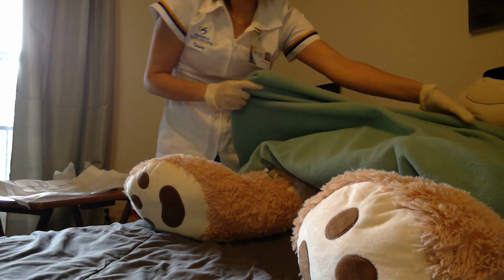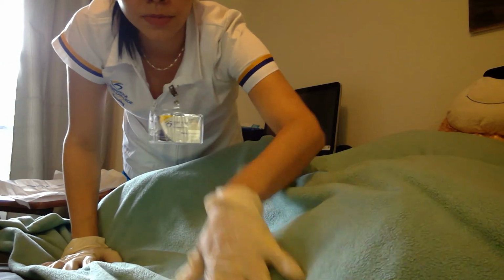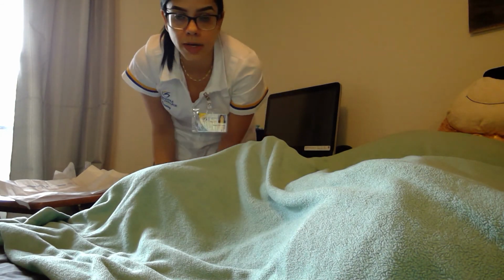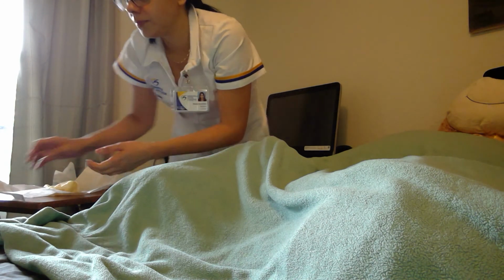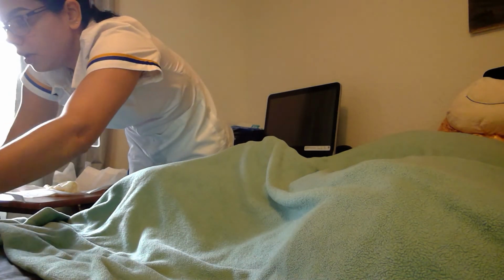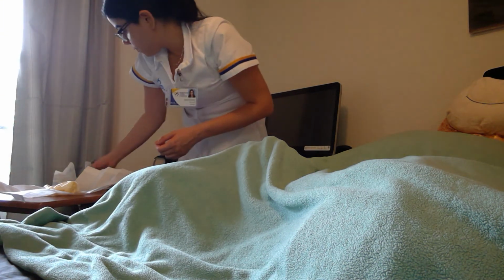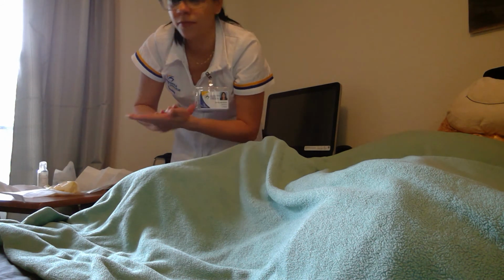Make sure that she is covered, that she's comfortable. You want to take all of your stuff and you want to throw them in the trash. Okay. Trash, trash, trash. Okay. You're going to perform hand hygiene.